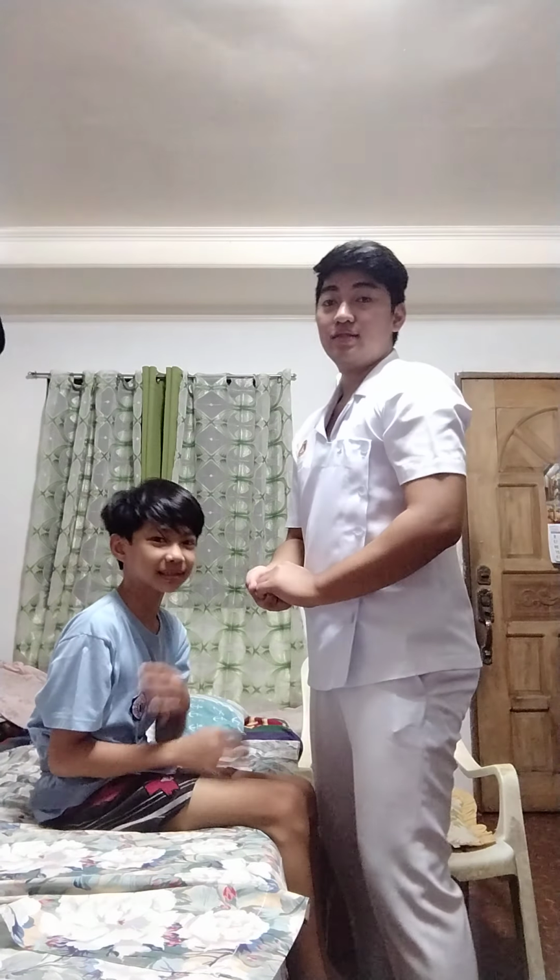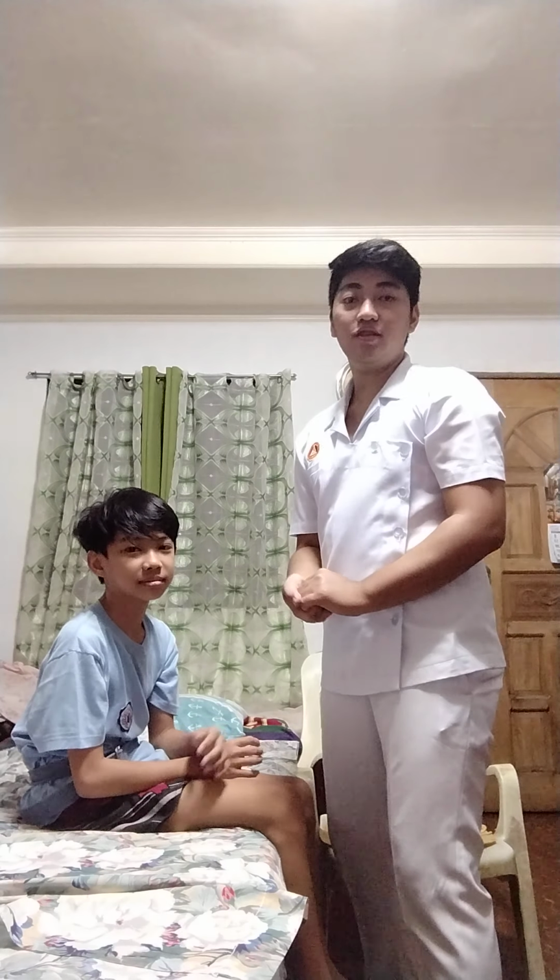And so next, stand facing the patient and spread your feet about shoulder width apart and flex your hips and knees.